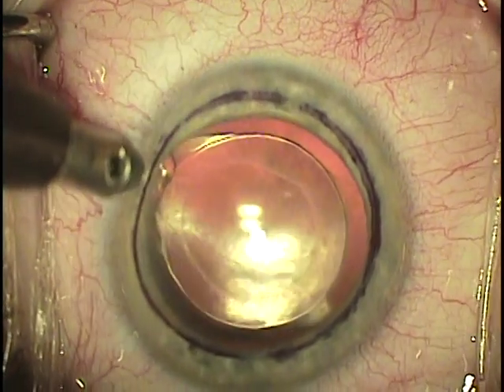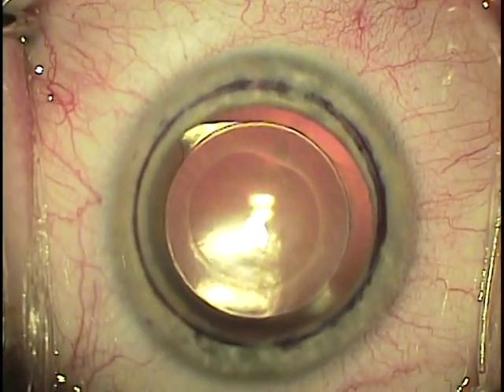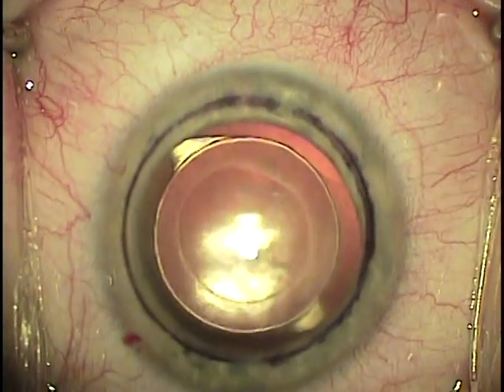I start the case by making three 1mm paracentesis incisions, two superiorly, one inferiorly. This is done with a 1mm blade and done vertically, not in the beveled entry site.